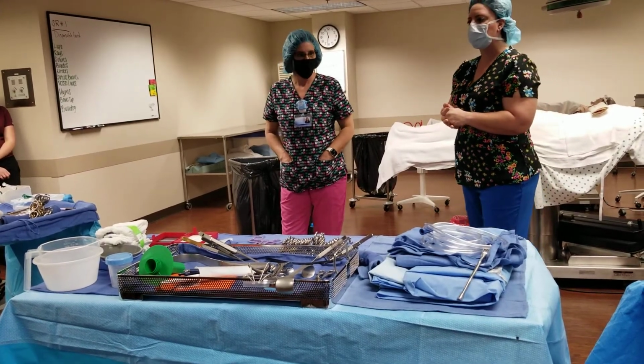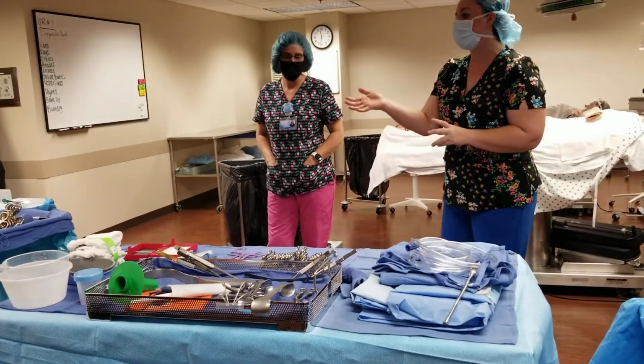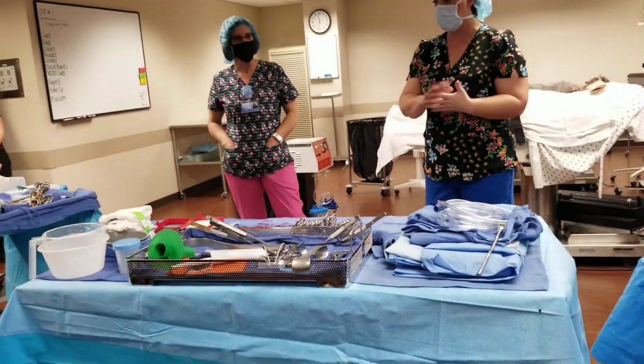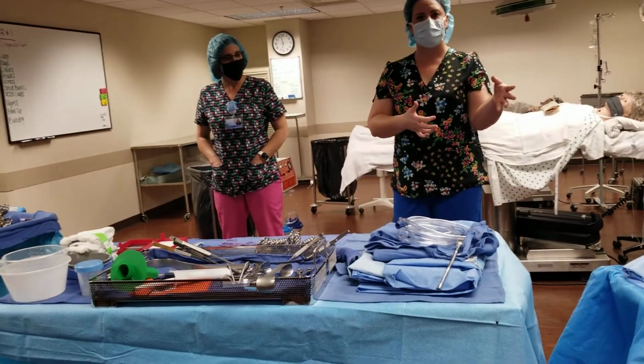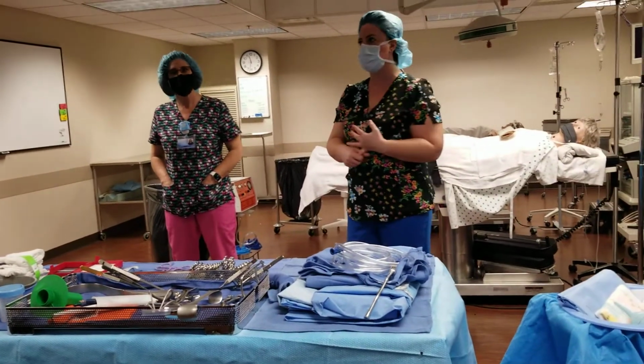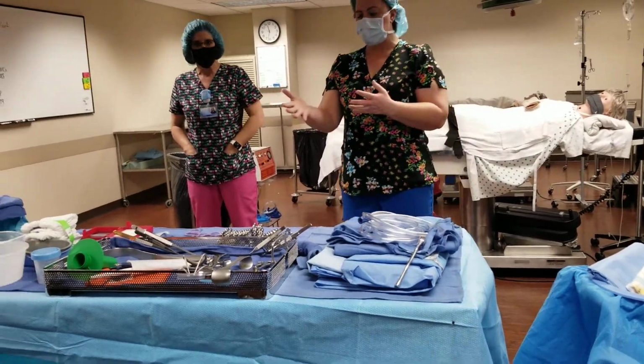Oh no, I lied. They'll take out the placenta. And at that point, they might want to do cord blood. So they'll do cord blood. They'll deliver the placenta. Usually, you want a big bucket to put the placenta in. Sometimes they'll want to send it. Sometimes they won't. You need to ask. And then they'll wash up.